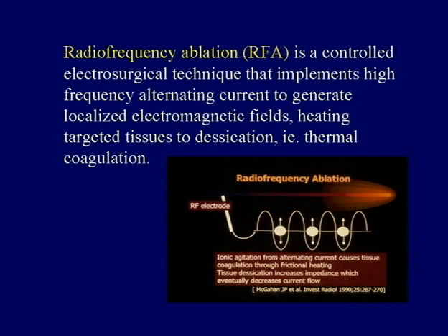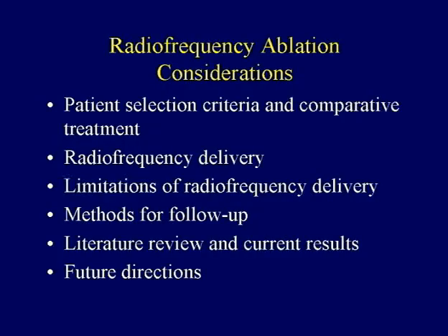I want to acknowledge my colleague, Dr. Rob Su, who dragged me kicking and screaming into RF ablation in the lung and who really heads and runs our program. As we all know, radiofrequency ablation is the controlled application of a high energy source, and it is thought that the thermal ablation is very effective in destroying primarily the cancer cell that the lesion is targeted, as well as some adjacent tissue, and it's a well-established technique in many parts of the body today.